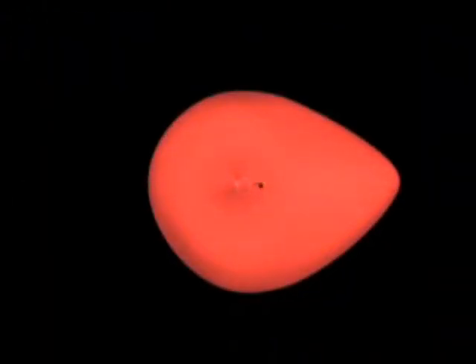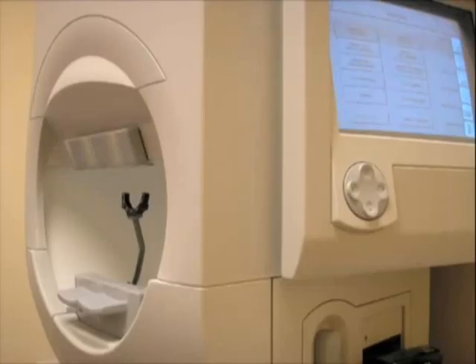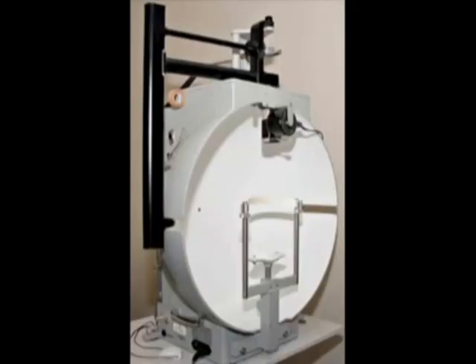So far we have looked at field defects as being absolute. In practice, the visual field is like an island of vision, with the centre of the vision being most sensitive. This means a small or dim target can be detected centrally just as easily as a bright or large target is detected peripherally. Accurately mapping the shape of this island of field allows for early detection of problems and to demonstrate changes over time. Two machines are in common use in the UK to assist with this. First is the Humphrey Field Analyzer, second is the Goldmann Visual Field.